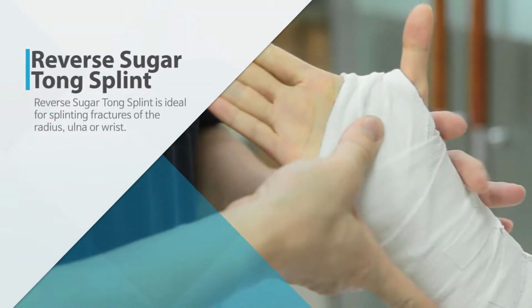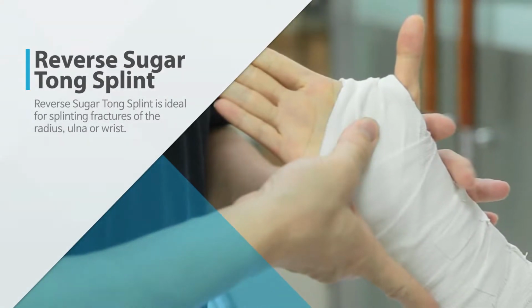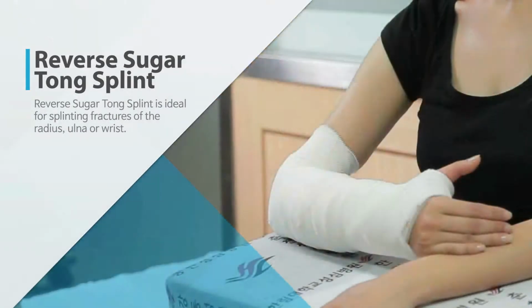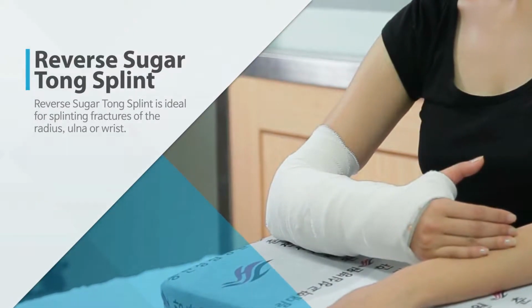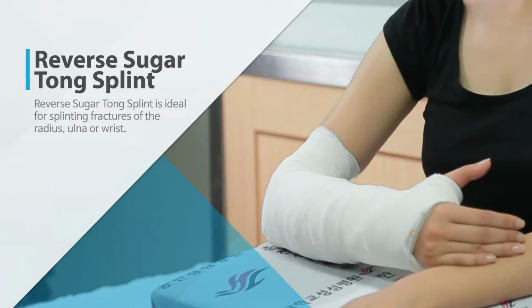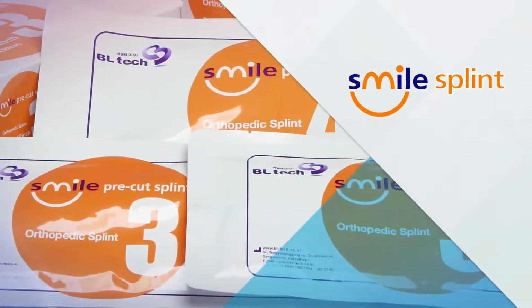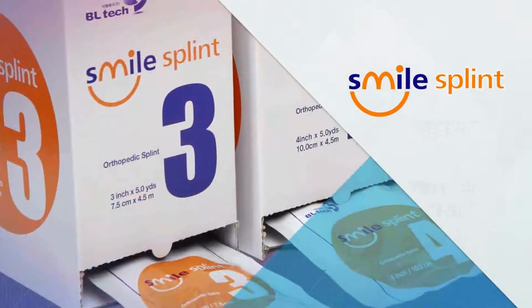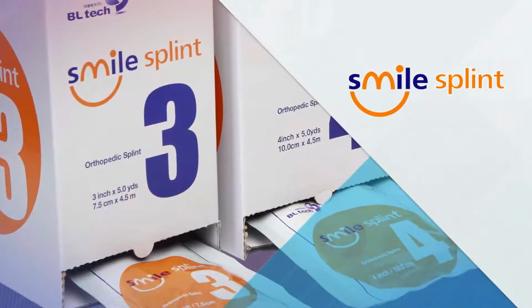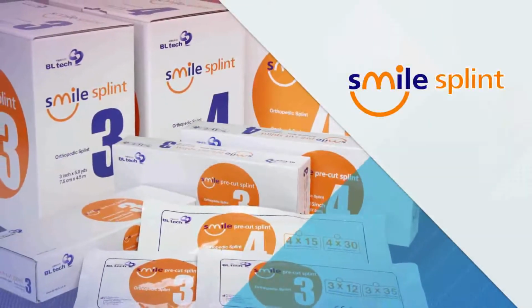Reverse sugar tong splint is ideal for splinting fractures of the radius, ulna, or wrist. It prevents flexion and extension at the wrist, limits flexion and extension at the elbow, and prevents supination and pronation. This video will show you how to apply Smile Splint, whose paddings can be opened and recovered thanks to its unique structure. You can cut the substrate inside the paddings, which allows a lot of variations of application.